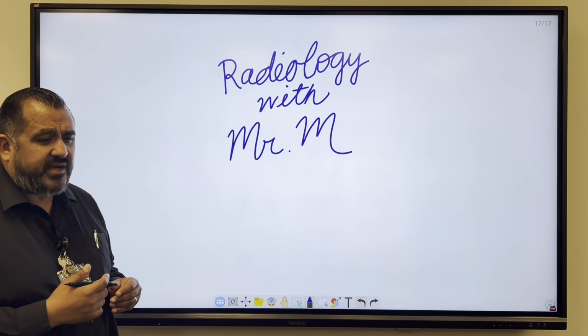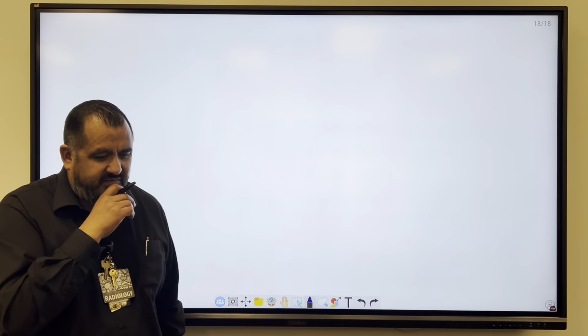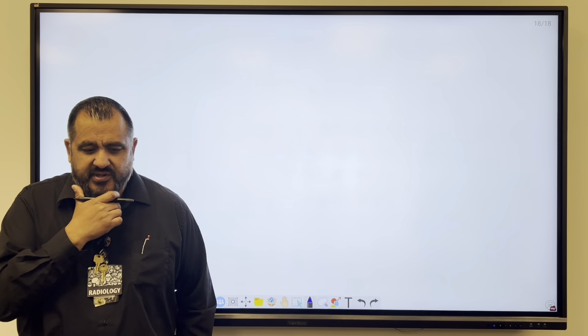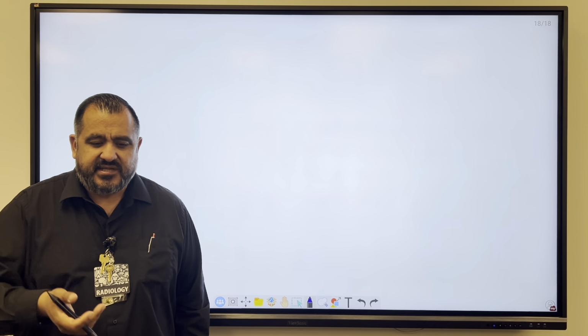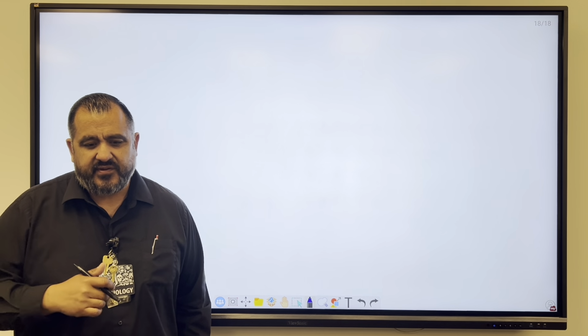But we're going to be covering digital processing systems, and I'm going to give you guys, like I said, a brief overview of how the images are being produced without going into super detail. But again, I want to try to keep all the key terms still involved with this.